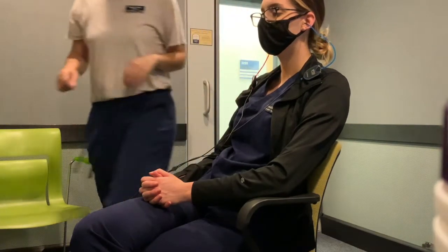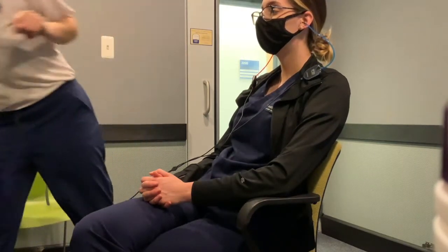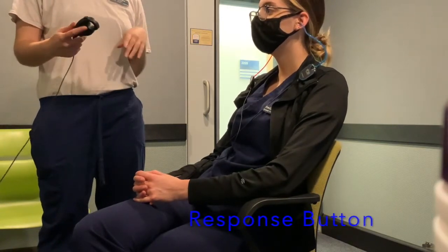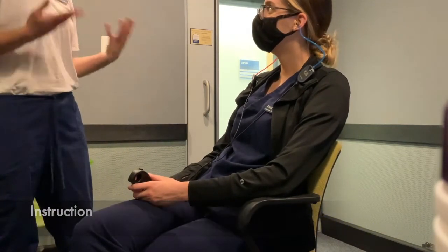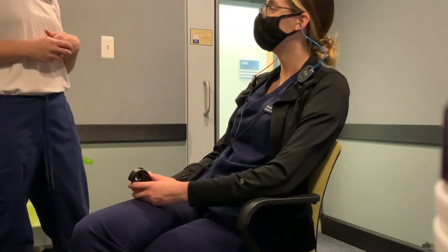All right. Then what you'll do is you will take this here. This is going to be an instrument so that the client can respond when they hear a sound. So I'll say, please take this. You're going to hear some tones. When you hear the tone, even if it is very soft, I want you to click that button when you hear it, okay?